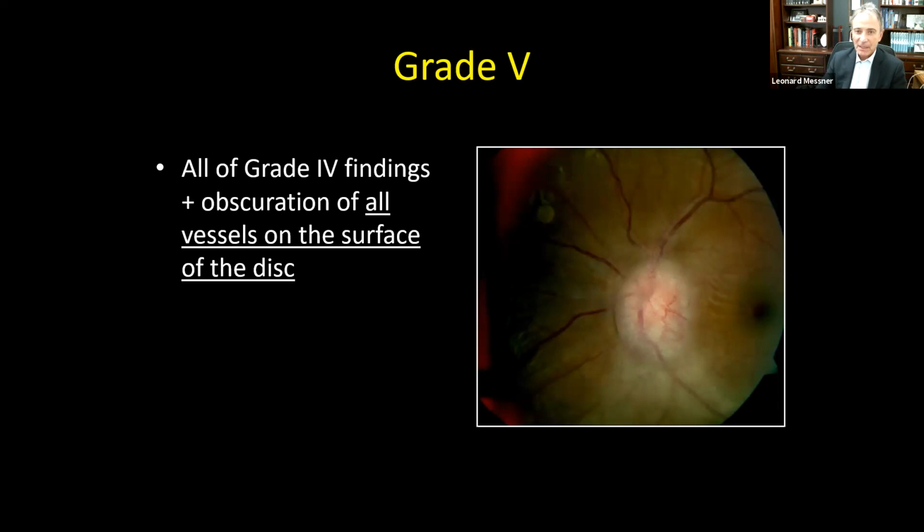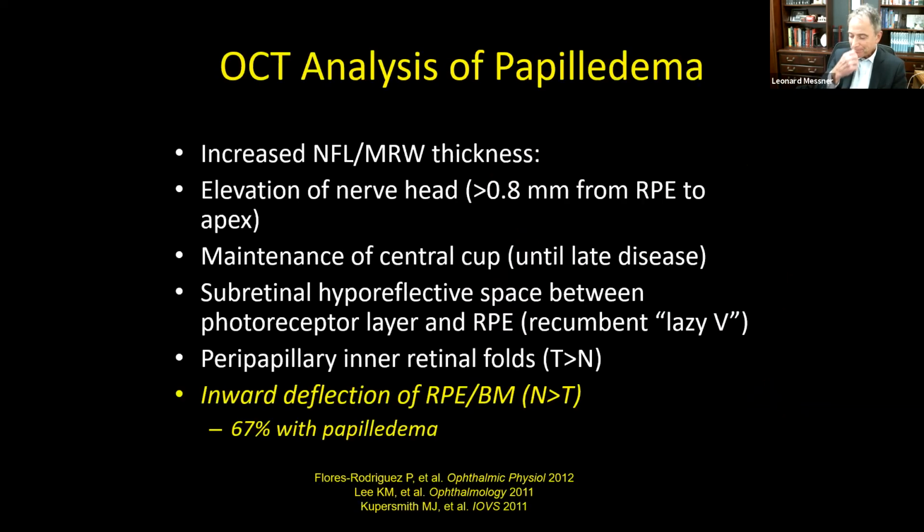So with that, I'd like to talk a little bit about the OCT findings that we associate with papilledema. And I'd like to preface this by saying that OCT is an aid. It is not the definitive diagnostic tool, but it is very, very helpful, as we'll see going through a number of cases, in conjunction with the clinical examination of the patient, as well as other features that may be consistent with elevated intracranial pressure.